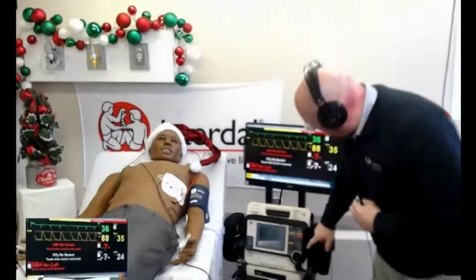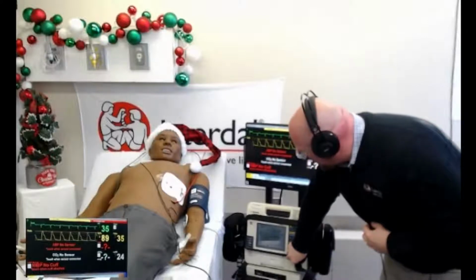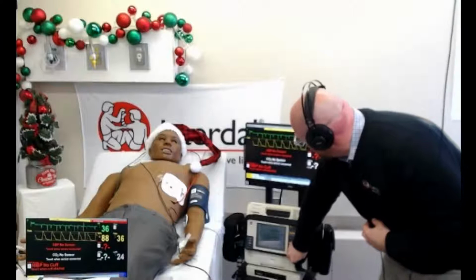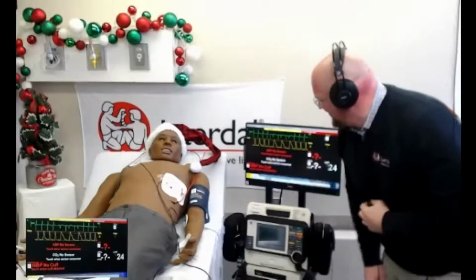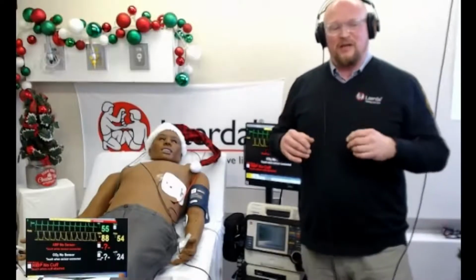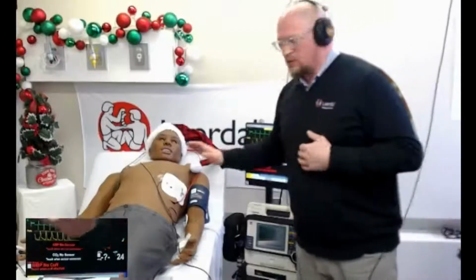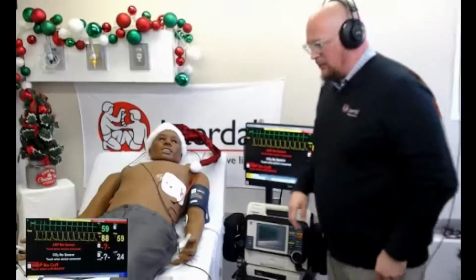So let's start with a little bit of pacing. I'm going to start my pacer at 60, and I'm going to increase my milliamps. Now again, this is live going to my mannequin, and if I were to look on my LEAP, I would actually see what milliamps I'm locking into. There we go. I was just doing that as a little bit of fun, that once the simulator picked up that the pacing started, I just had a little bit of sound for all the pacing that he's going through. Again, I'm really sorry, I haven't given him any sedation. That would definitely be recommended at this point before this patient got really mad at me.